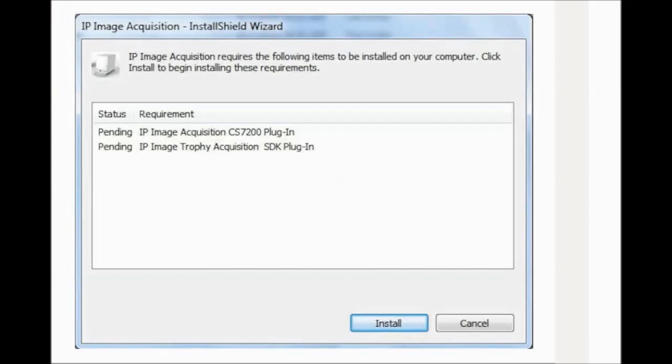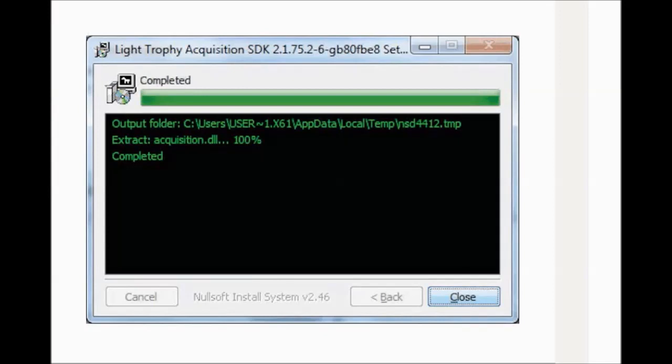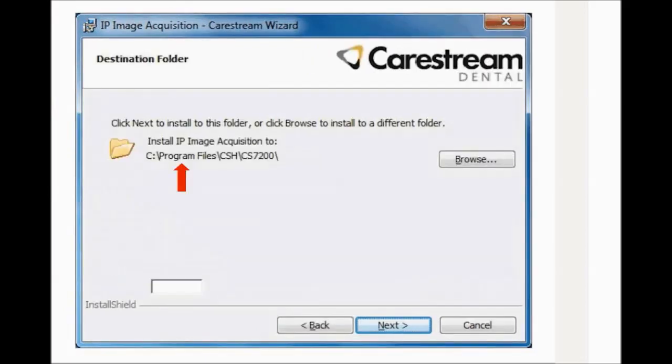CS7200 Drivers Installation. Insert the scanner driver's DVD-ROM into the DVD-ROM drive. Wait for the installation program to start. The Installation Wizard window is displayed. Click Install to install the required plugins. The Light Trophy Acquisition SDK window is displayed. Select only the components that you want to install and click Install. Wait until the components are installed and the completed window is displayed. The Welcome window is displayed — click Next to continue. The Destination Folder window is displayed. Click Next if you accept the default destination folder, or browse to choose another, and then click Next.